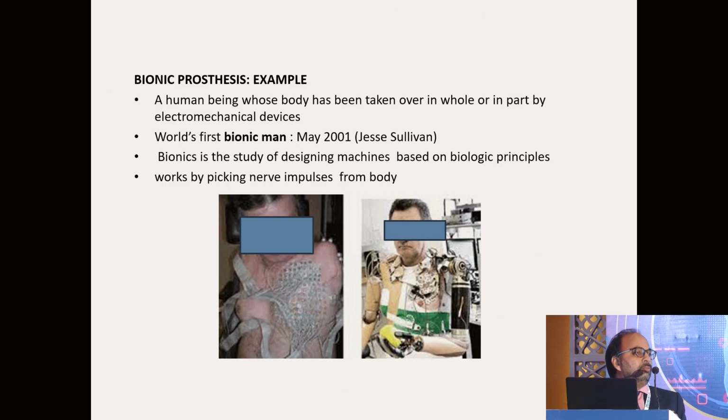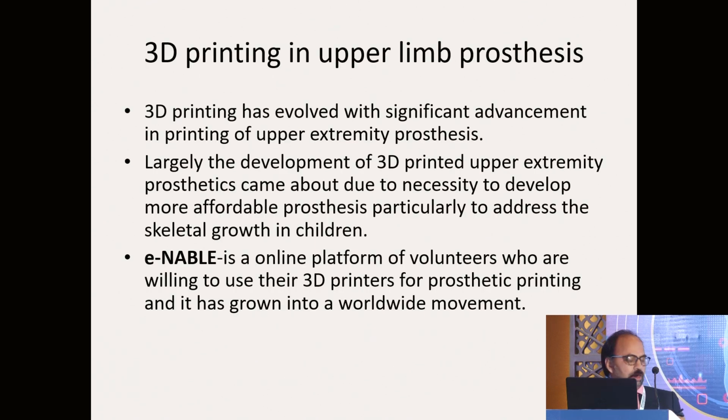So usually it is missed or skipped during our teaching. So my request is, give a little focus on that also when you are doing your preparation. And one last thing, sorry, 3D printing is also available. But in my personal experience, I have seen that 3D printing in upper limb prosthesis has not been so successful, though people are trying.